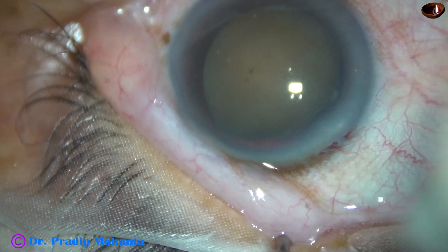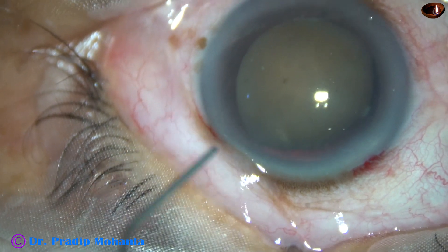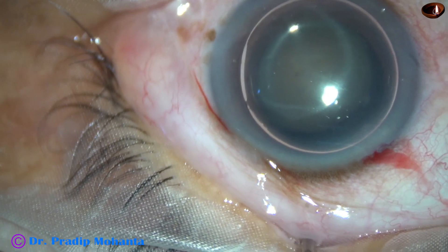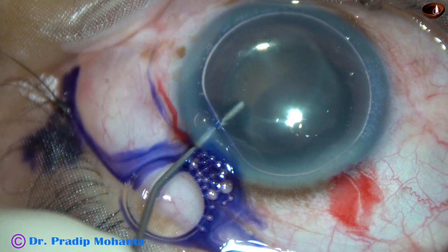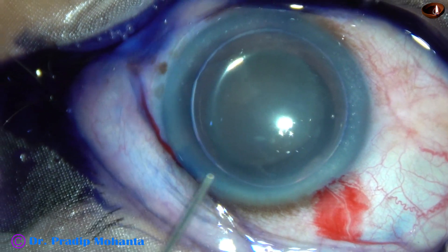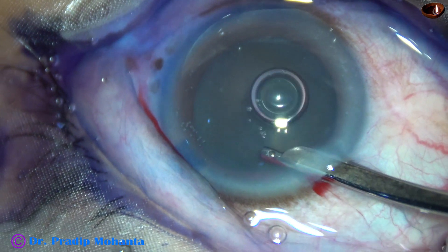I have taken up this case for surgery. I don't know whether there is any zonular weakness or not, but it is likely that this cataract is associated with zonular weakness. The sequence of events in this case is likely to be a hypermature morgagnian cataract, and then the liquid part has been absorbed. The patient probably had a mild form of phacolytic glaucoma, and gradually the patient recovered on its own. The patient has come for surgery very late, but it could be because of the lockdown due to COVID-19.